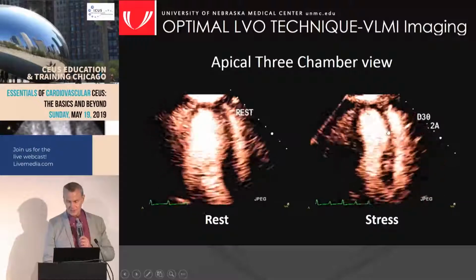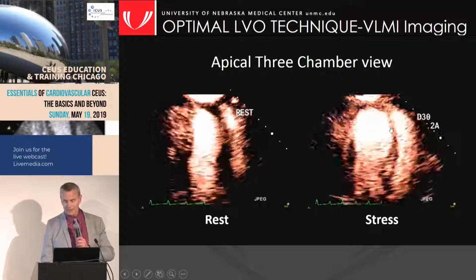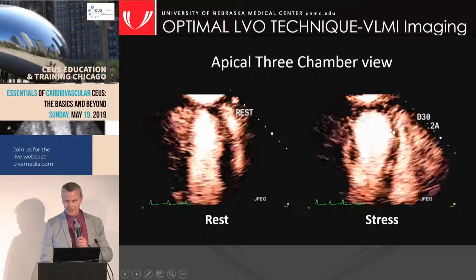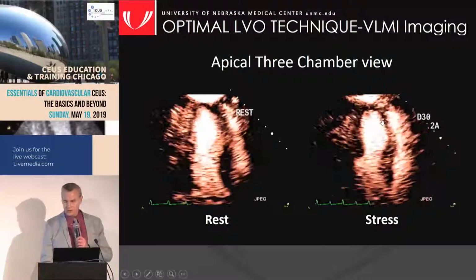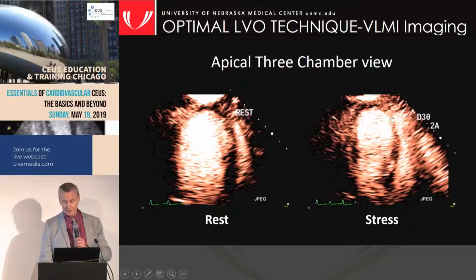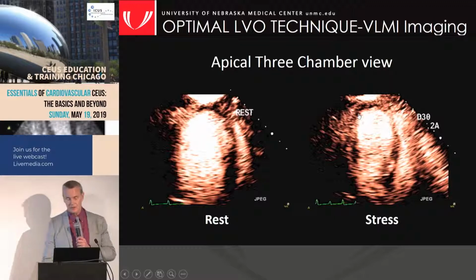I don't know if you can see that, but this started to replenish here. So we felt there was still some viable ischemic myocardium here. One, because in looking at perfusion, which we'll talk about in a moment, there was replenishment of contrast within this segment that was hypokinetic. Eventually, it was delayed, but it did eventually replenish. We thought there was definitely some scar, like right here. This did not replenish here. We called it a mixture of anteroseptal and apical ischemia with at least one segment of scar. That's the way we would have interpreted that. And one thing we were also questioning was this inferolateral segment, just in terms of perfusion.